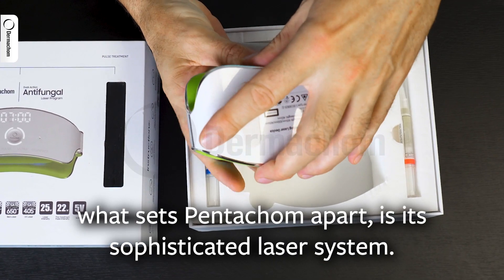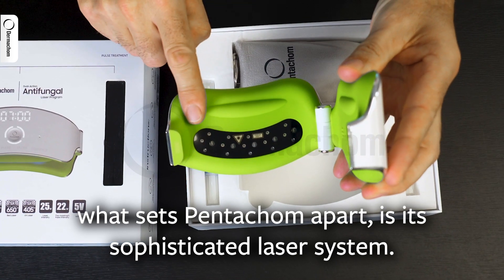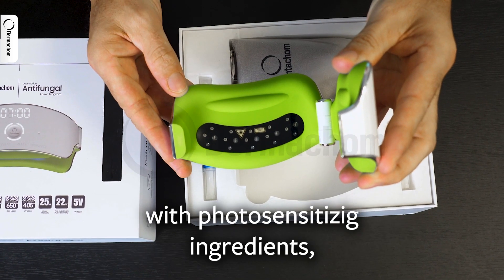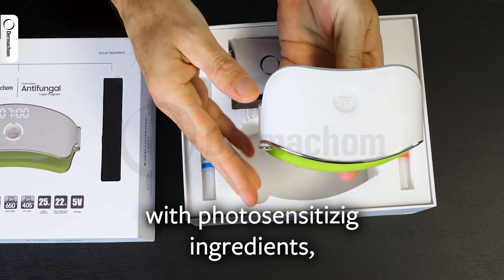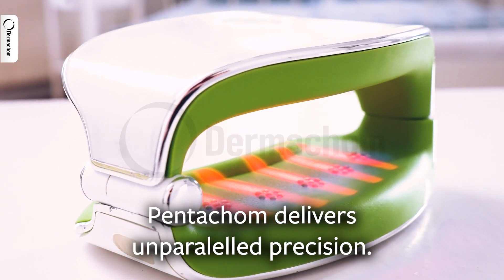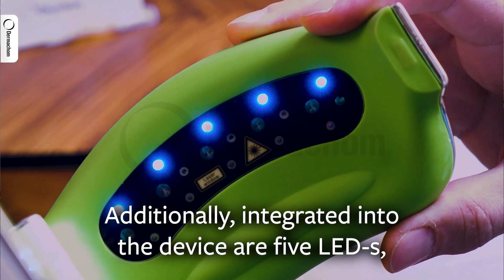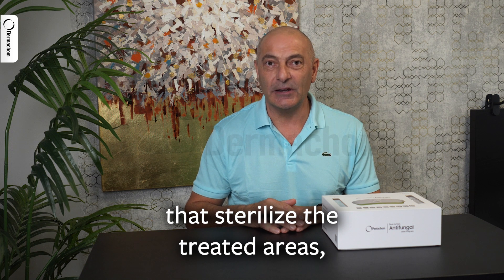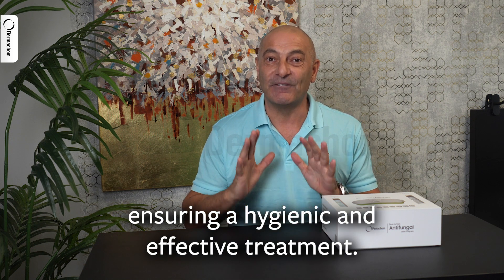What sets Pentacom apart is its sophisticated laser system. With 15 lasers calibrated for optimal performance with photosensitizing ingredients, Pentacom delivers unparalleled precision. Additionally, integrated into the device are five LEDs that sterilize the treated areas, ensuring a hygienic and effective treatment.